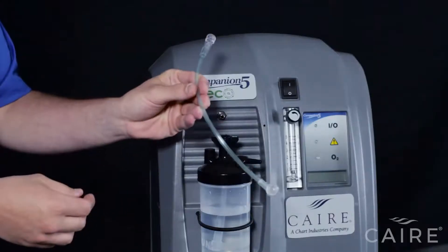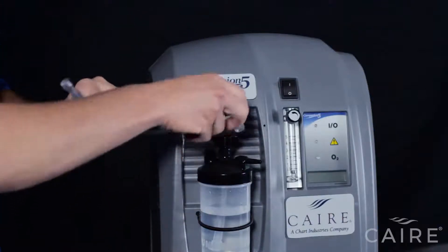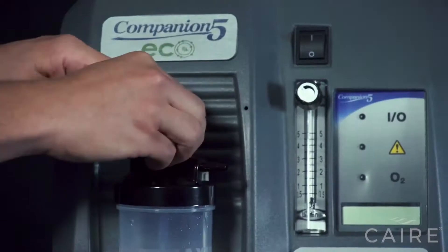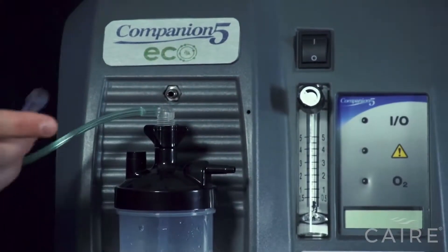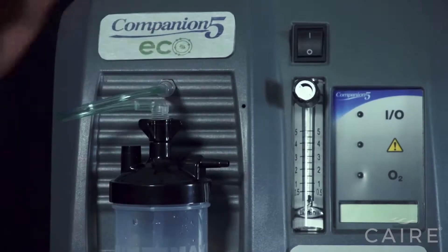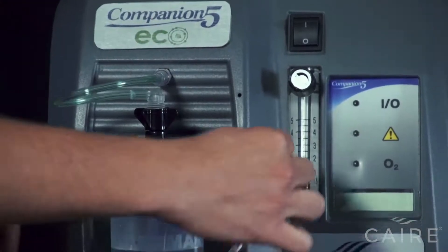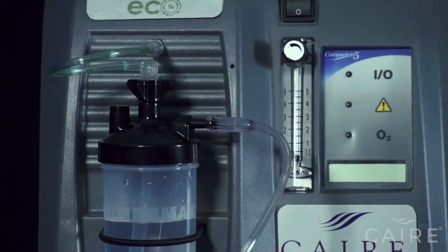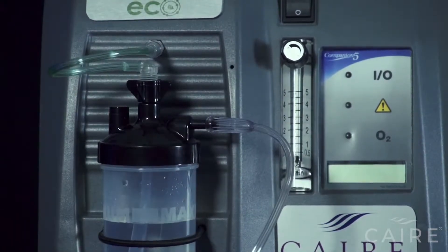Each Companion 5 comes with a humidifier adapter tube. You'll screw this into the top of the humidifier bottle. Once you've screwed it in, loop it around and attach it to the outlet. And then you'll attach your cannula or tubing outlet to the barb on the lid of the humidifier bottle. Now you're hooked up and let's begin the power on.